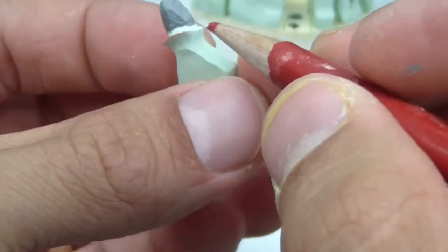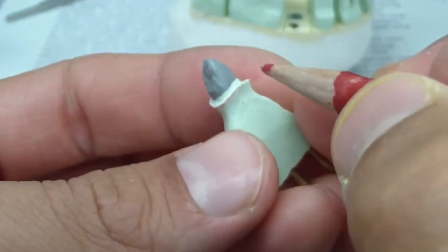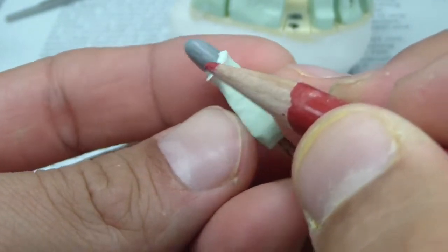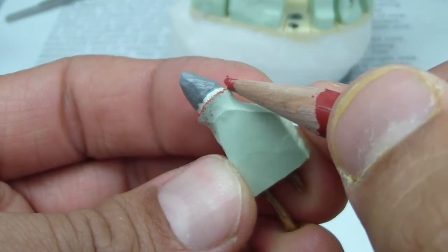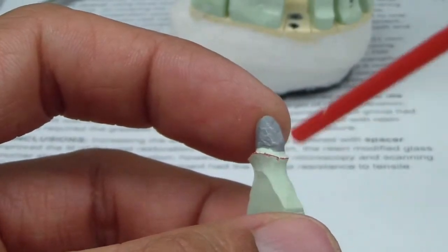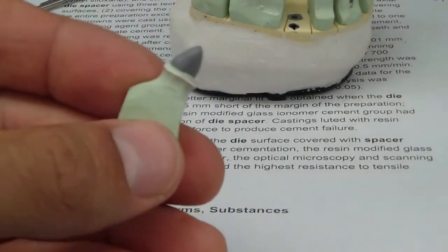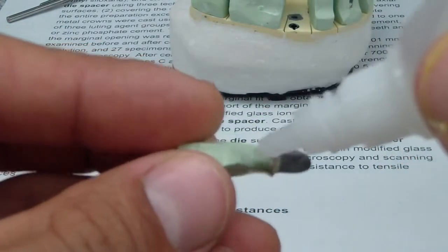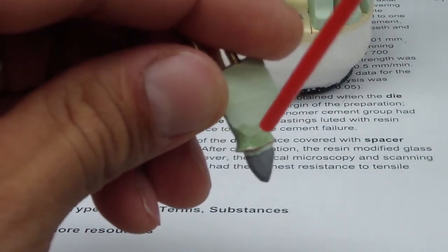We've got a nice thin layer. There we go — just do some air and pour that in. Then we're just going to place some cyanoacrylate, not only to harden the die and prevent it from wearing out, but also to keep the pencil on and act as a thin spacer.